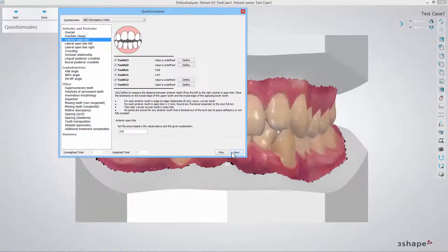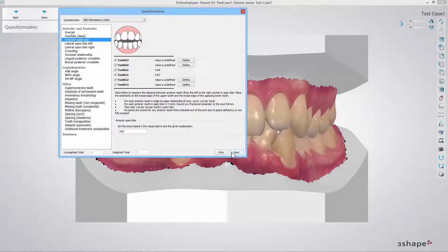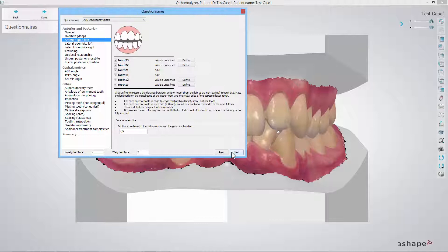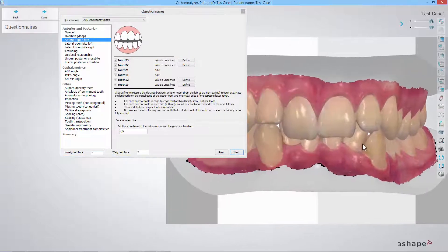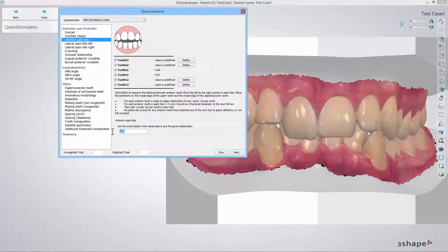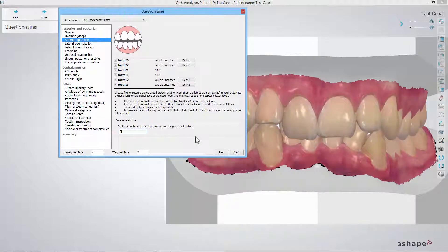In the anterior open bite step you should inspect the model from the left to the right canine. In case there is an open bite, click the define button and place a point on the incisal edge of the upper and the incisal edge of the corresponding lower tooth. Fill in the score calculated as the sum of the open bite scores given in millimeters.